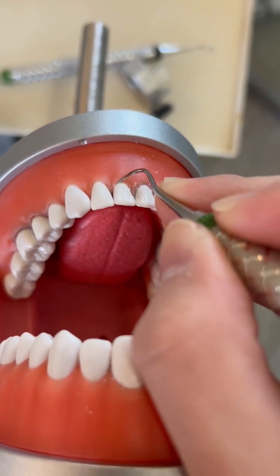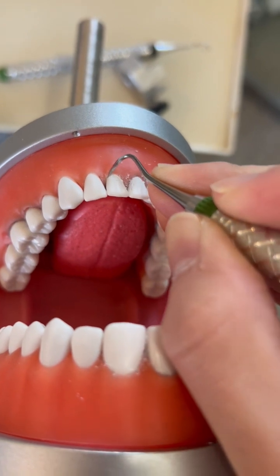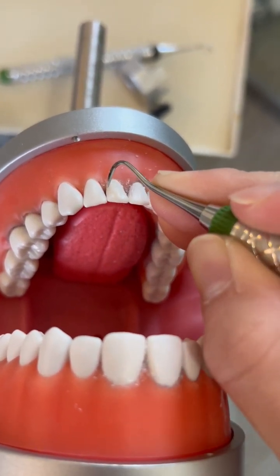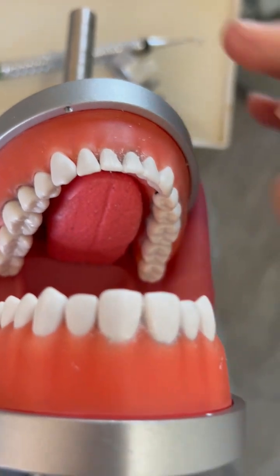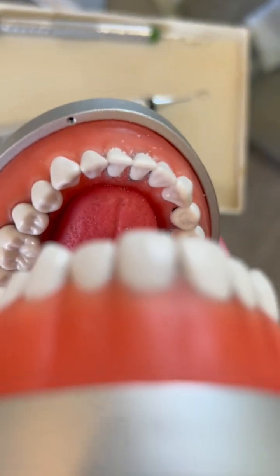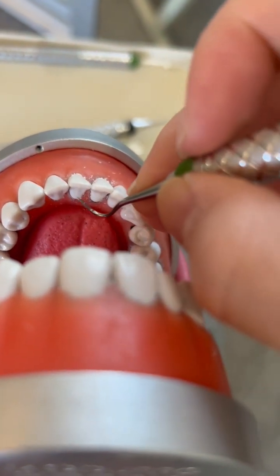Start at the midline, side to side, pivot and roll, side to side, pivot and roll. And then move on to the linguals. Use the secondary blade.